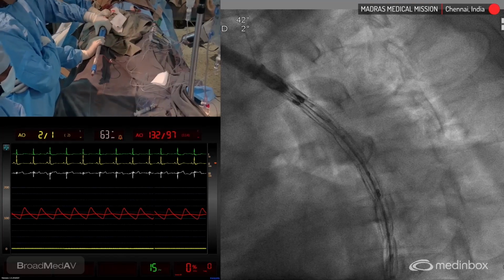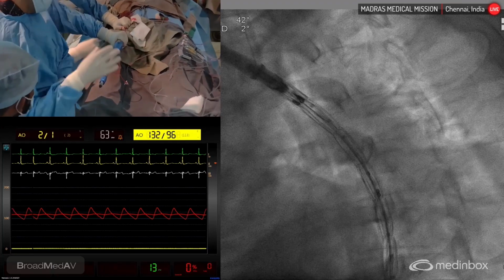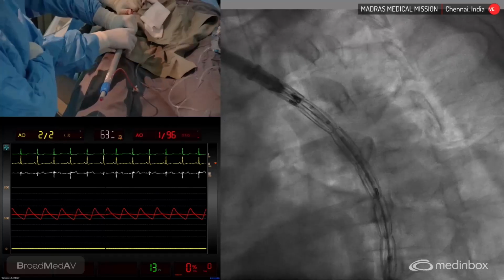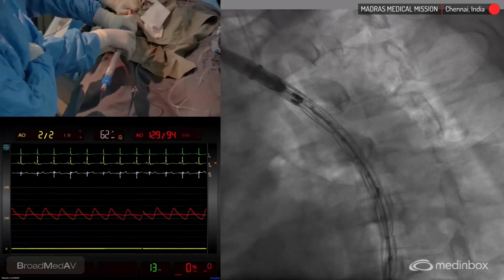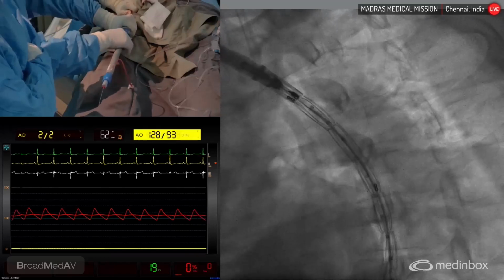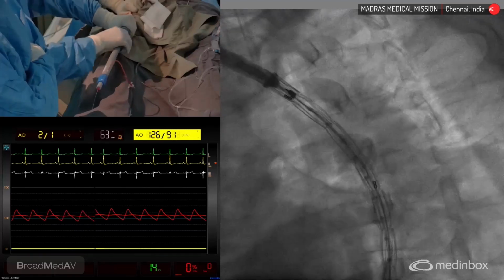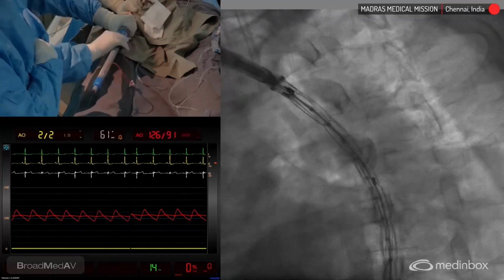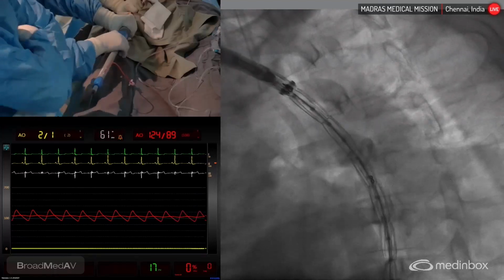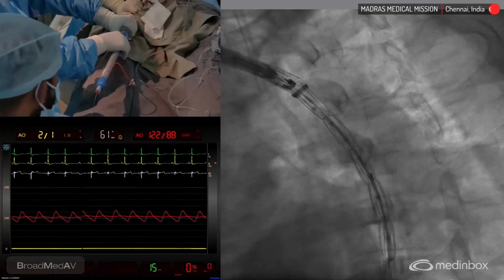You have to hold this hand grip firm so that the stent doesn't move. Then you have to start unlocking this blue. So we'll start. We have to keep an eye on whether the stent is moving or jumping down. So the sheath is slowly coming back. Now you see the figure of 8 has come out.